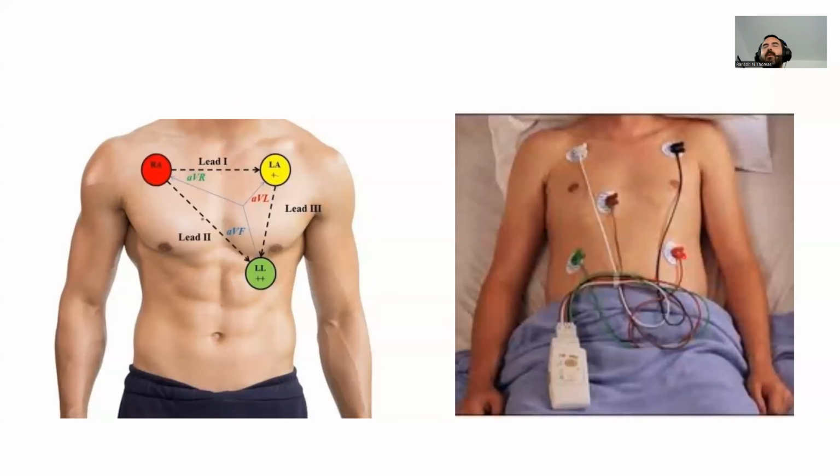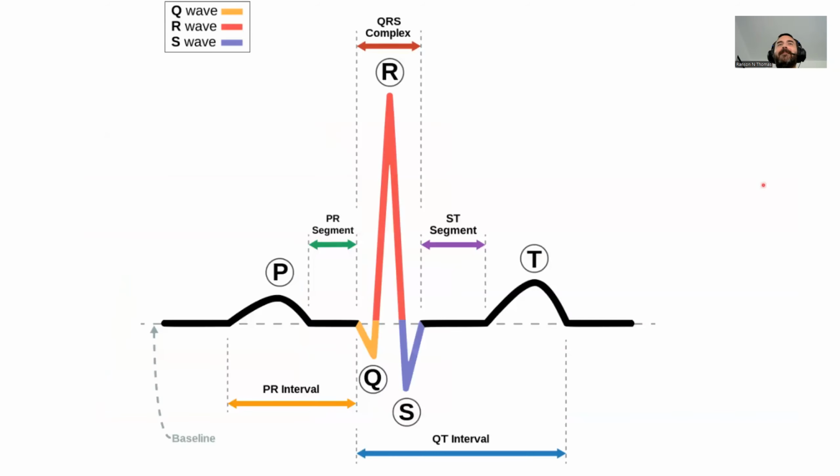The way I was taught to remember it, and if it helps you, great: black is smoke, red is fire, smoke over fire. White is snow, green is grass, snow over grass. And then brown's just in the middle, or you can think of it as earth, which centers us all. The leftover goes in the middle, however you want to think about it.